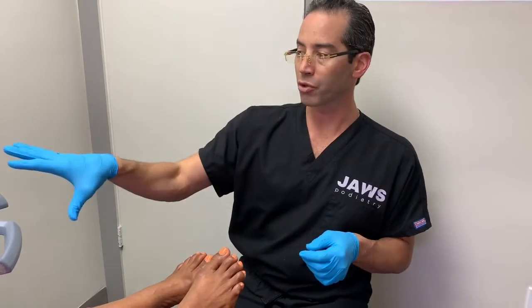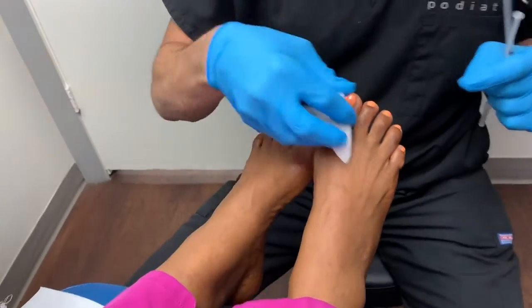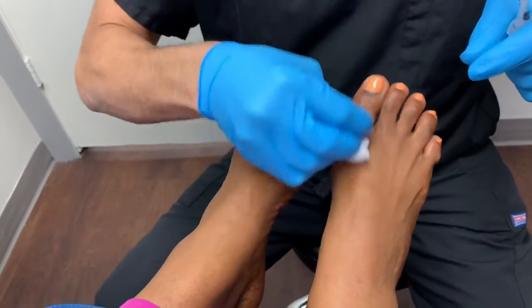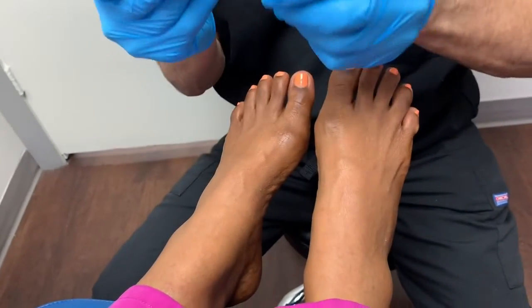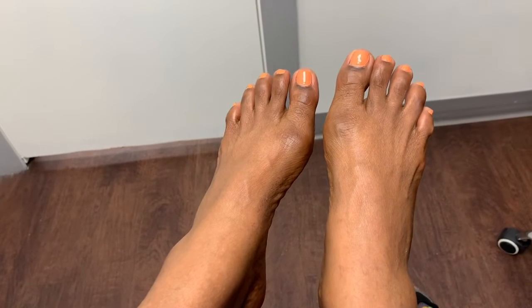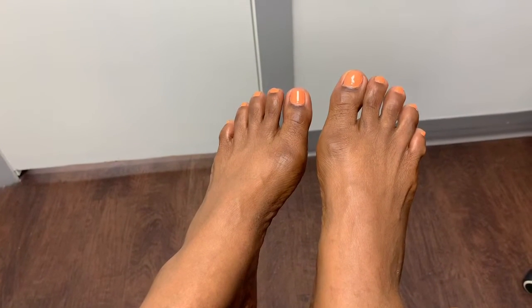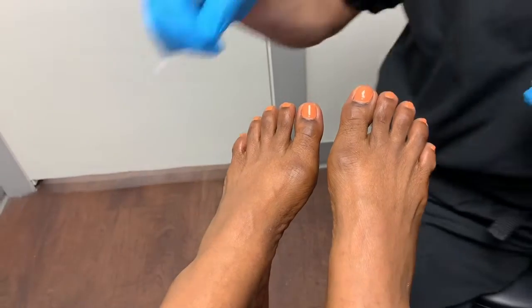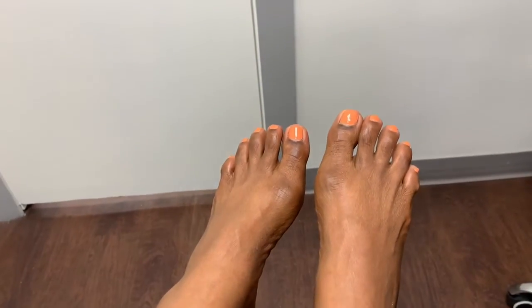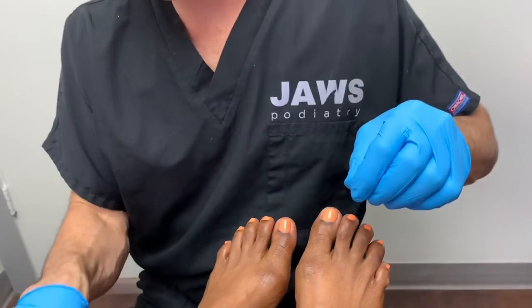We've already marked the spot using an ultrasound, so now we're going to go ahead and move forward with the two injections — one injection on each side. We've got a smaller needle because we want to make sure that we have a happy patient and a happy doctor.